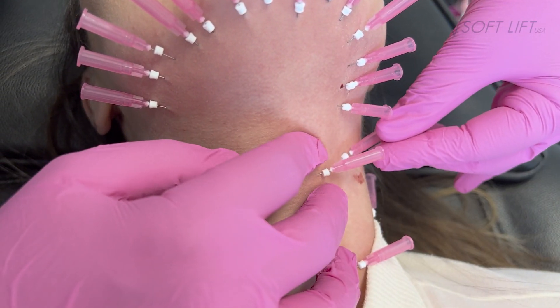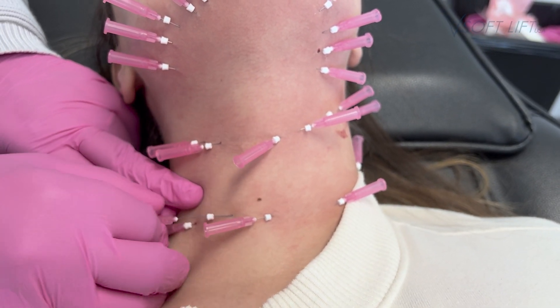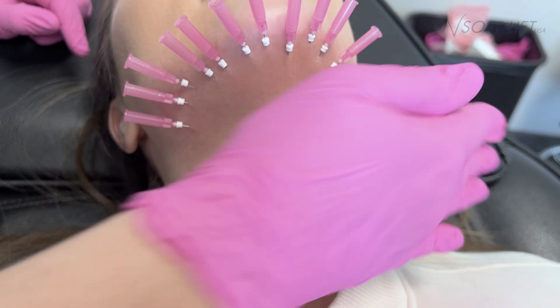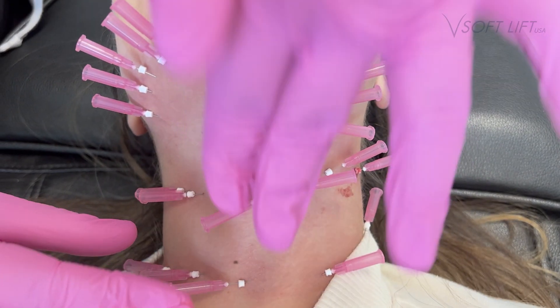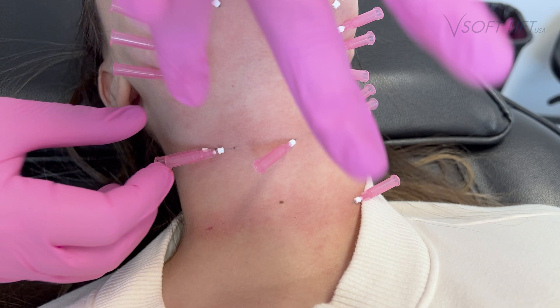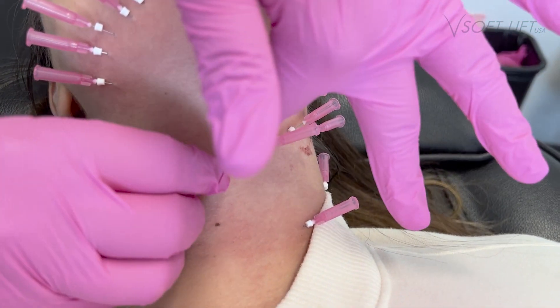As you can see, I've placed these directly into that necklace line. We will stimulate collagen about one and a half millimeters from where the actual thread is placed. You can see how I have really nice equal coverage in the areas I'm targeting. I don't want to leave big gaps, because then we won't have collagen in that particular area. These threads must be placed fairly close together to maximize collagen production.